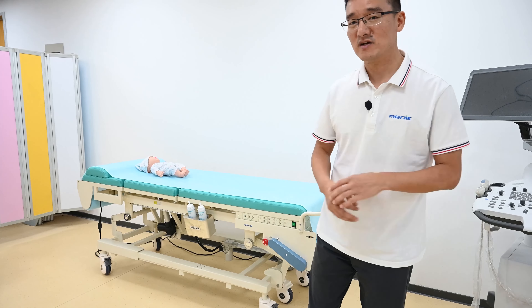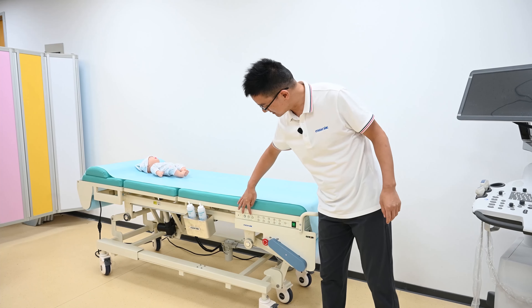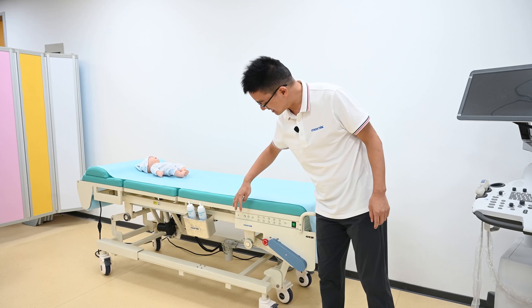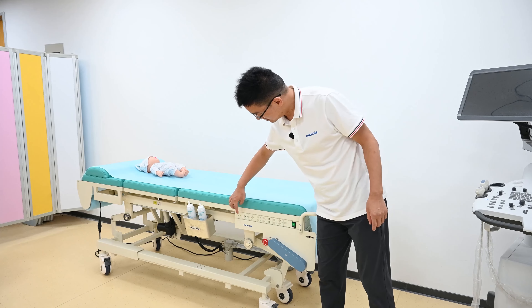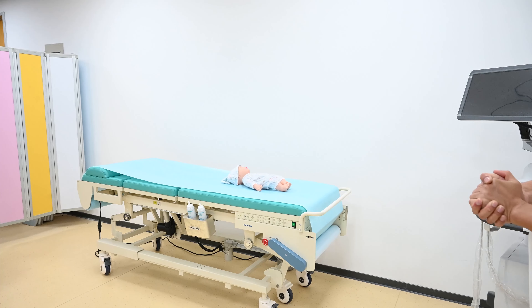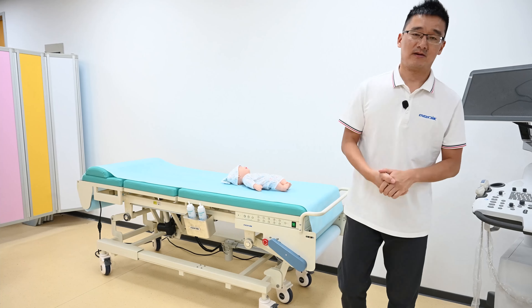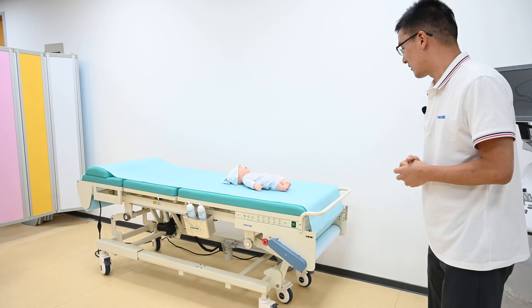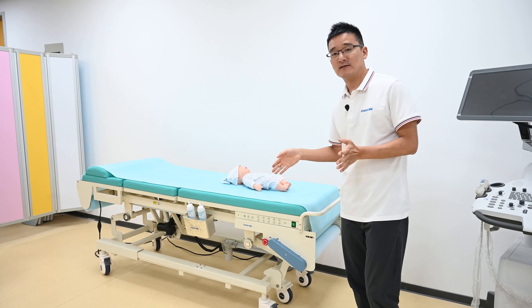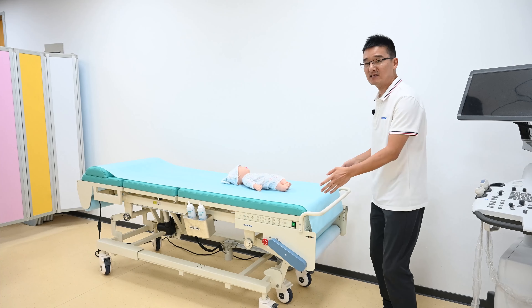The second unique function for this table is the automatic paper rolling function. We provide three options for the rolling distance: the complete length, the half size, and the one third. Let's operate the middle one — you can see the paper is rolling automatically. After one patient, the next patient can sit on without manually changing the paper. We also have an automatic correction system so the paper roll will never get distorted.